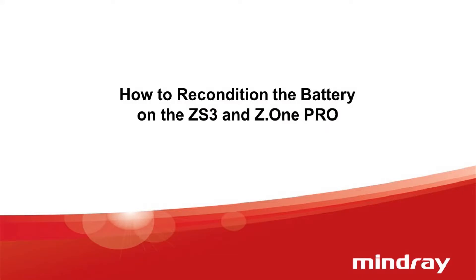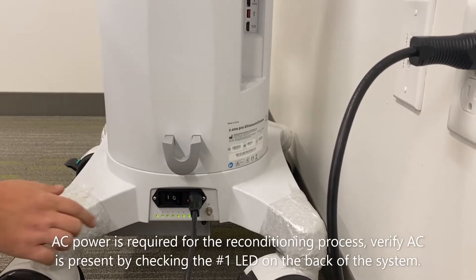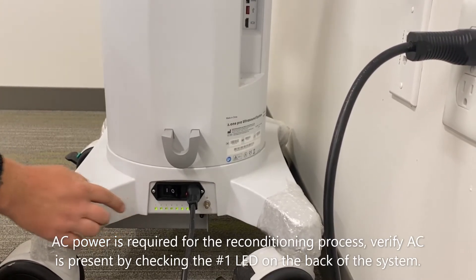In this video, we will be observing how to recondition the battery on both the ZS3 and the Z1 Pro systems. AC power is required for the reconditioning process. Verify AC is present by checking the number 1 LED on the back of the system.